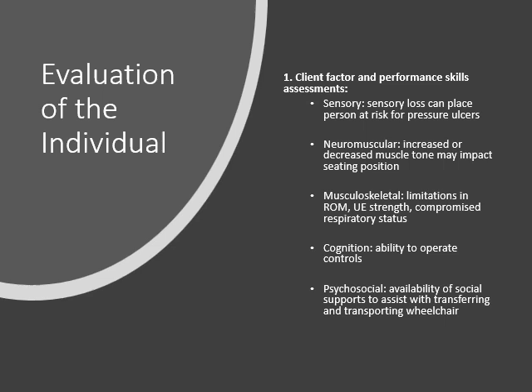The neuromuscular system. Does the client have increased muscle tone or decreased muscle tone? Do they have postural control? Do they have any abnormal reflexes? And what is their coordination like? Because those will also impact the seating selection.